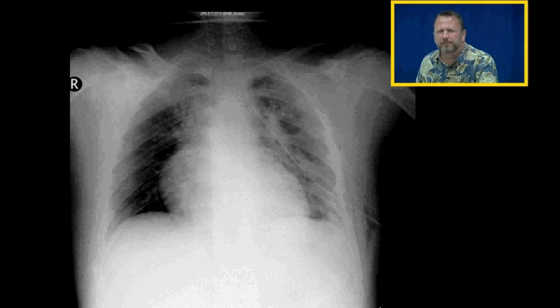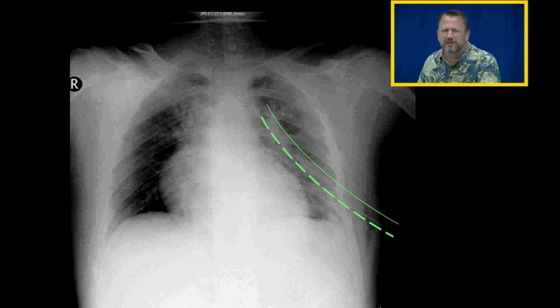Here's a chest X-ray with a chest tube inserted. If you look very carefully, the chest tube will have markings on it so we can see it on the chest X-ray.